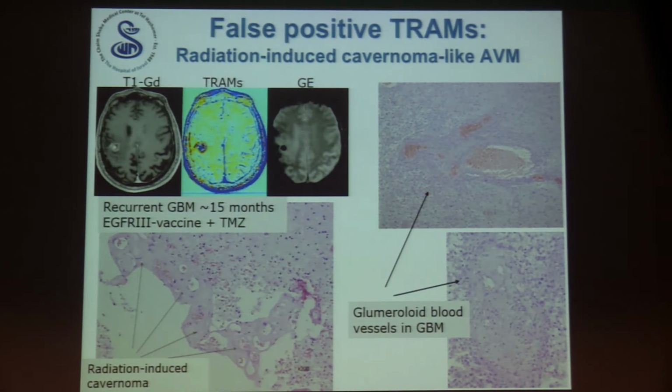And there's one more thing that we realized quite recently, and we went back to our database to verify it. Remember that I told you that we have 93% specificity, meaning that we are wrong 7% of the time, more or less. And we are mainly wrong with false positives. So we don't really miss tumors. This is our understanding so far, but sometimes we have false positives. And the only explanation we could find until now for false positives is vascular malformations or radiation-induced vascular malformations.